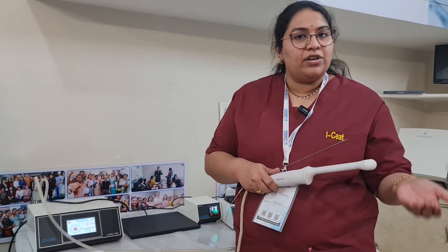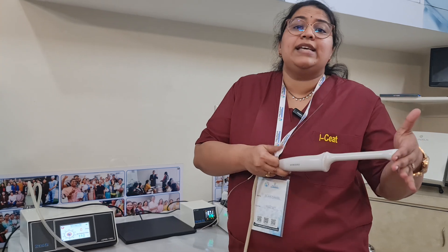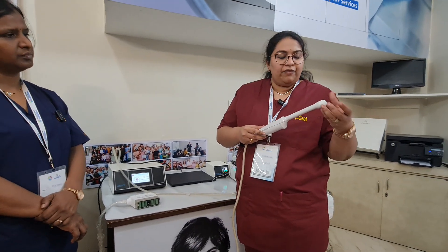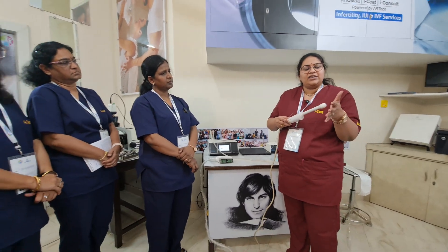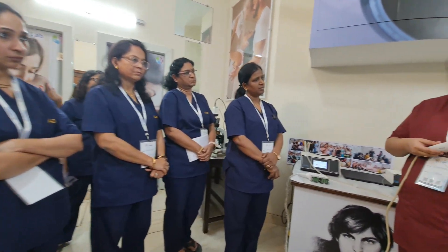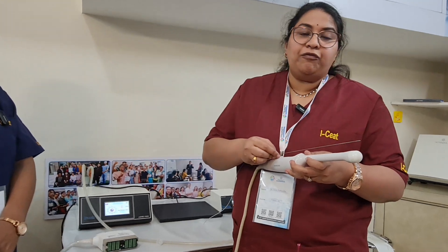First insert the transducer probe. The anterior vaginal length is about 9 centimeters and the posterior vaginal length is 11 centimeters. As we enter the vagina, we can firmly press and enter up to a range of 13 centimeters with the probe. We do this so that no tissue lies between the ovary and the probe — omentum, bowel, or bladder will slip off, giving correct access to the ovary.